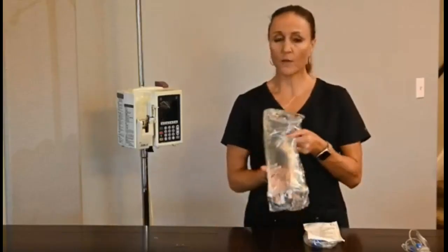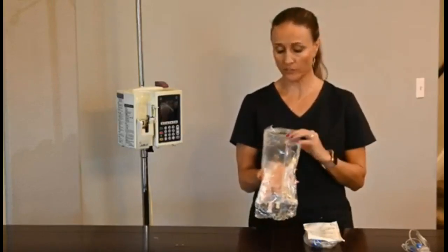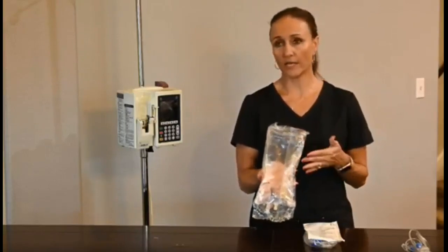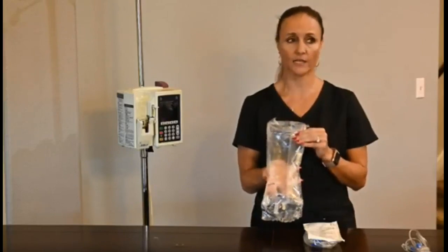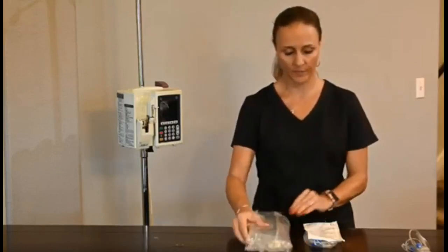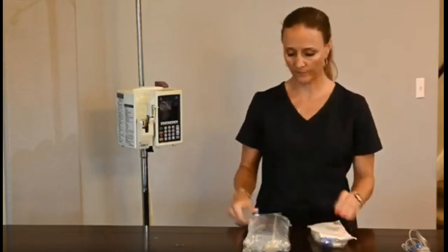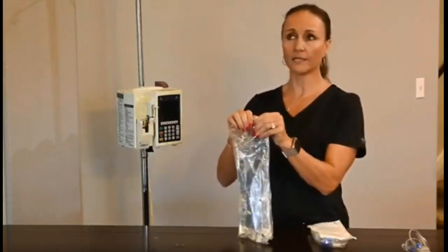With primary fluids, again, this is a medication, so you will have to have a doctor's order. This is normal saline. With primary fluids, medication and other additives can be added to primary IV bags, such as folate, thiamine, potassium, but that would be added by pharmacy. With primary fluids, you need primary tubing. So I have an order to hang normal saline at 100 mLs an hour.